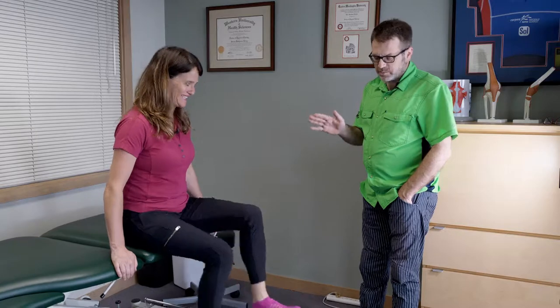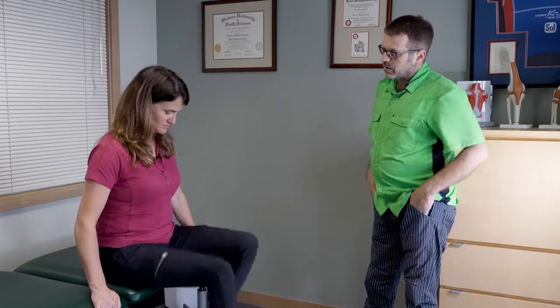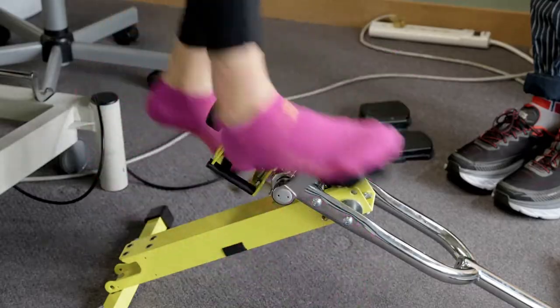That demonstrates the need to readjust your perch. In elevating the table, you have to reach a little farther through the pedal stroke, which means the knee doesn't bend quite as much at the top part of the pedal stroke. So for people who are limited in range of motion, particularly knee flexion or hip flexion, they'll have better tolerance a little higher up. If you start out high and are progressing their range of motion, you can bring them down.